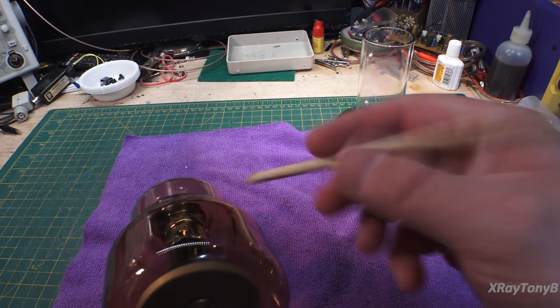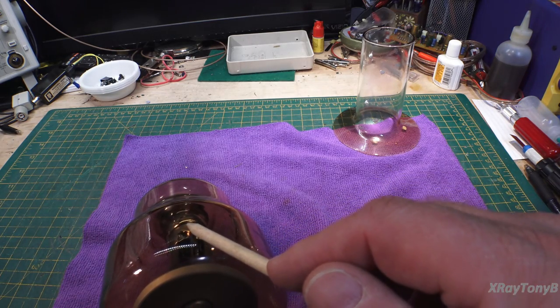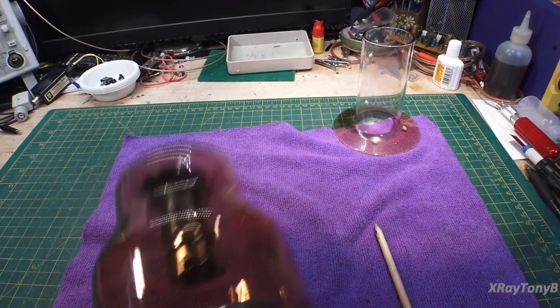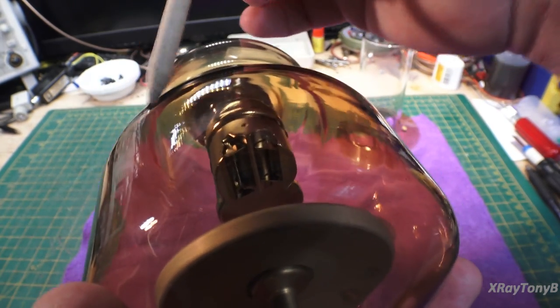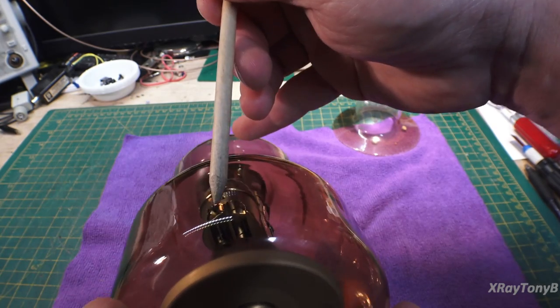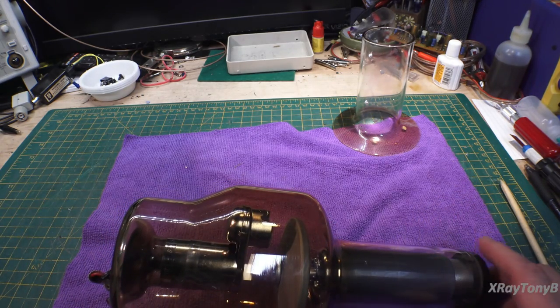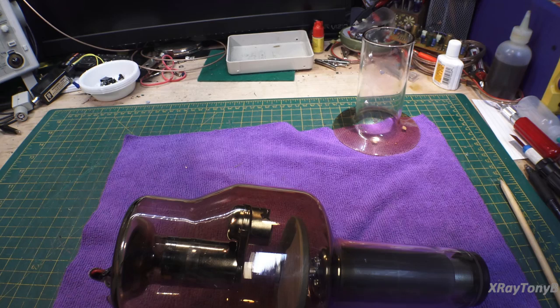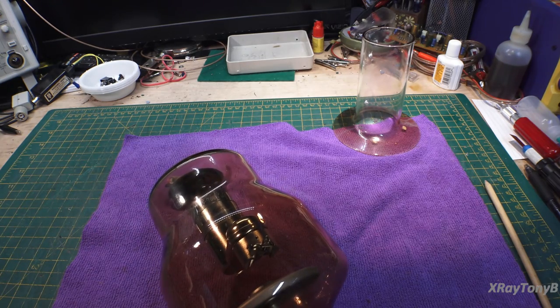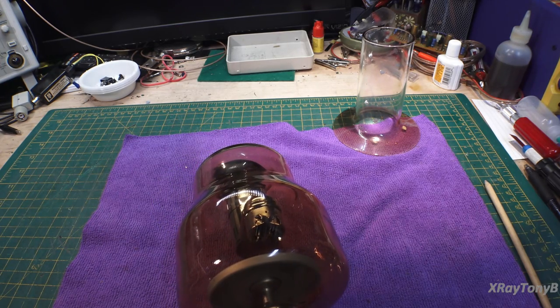And you can see inside here that this tube actually has a filament, just like every other tube, although x-ray tubes commonly will have two filaments, a smaller filament and a larger filament. I don't know if I can get you in there close enough, but you see them? So you have your large filament right here and your small filament here, and they have very similar characteristics to the dim and bright filaments of an old style automobile headlight, as far as the size of the filament and the voltage and so forth. These typically will run at about 12 volts, and at maximum current draw, the large filament can draw up to about 7 or 7.5 amps of current.